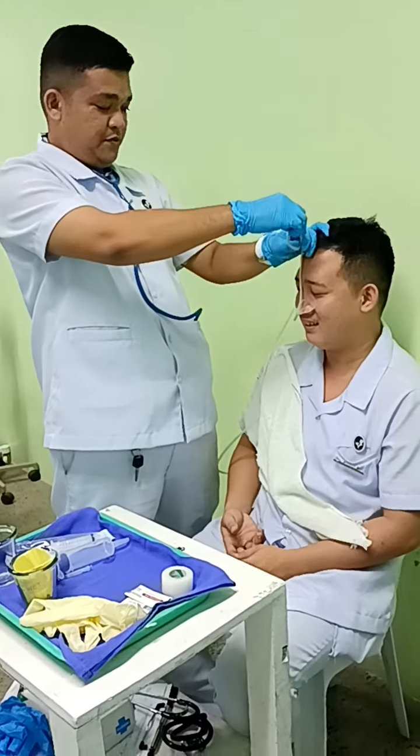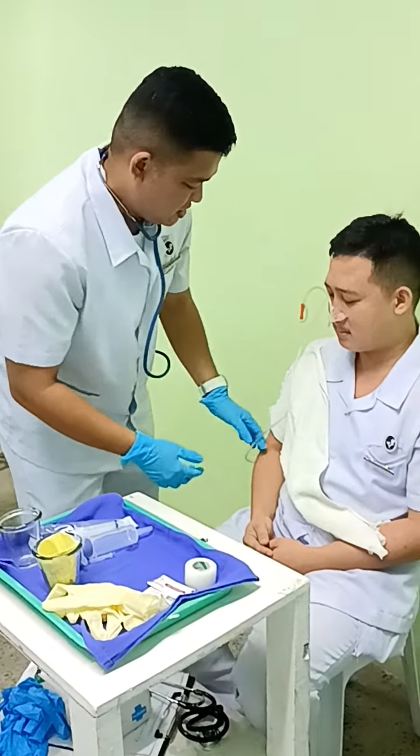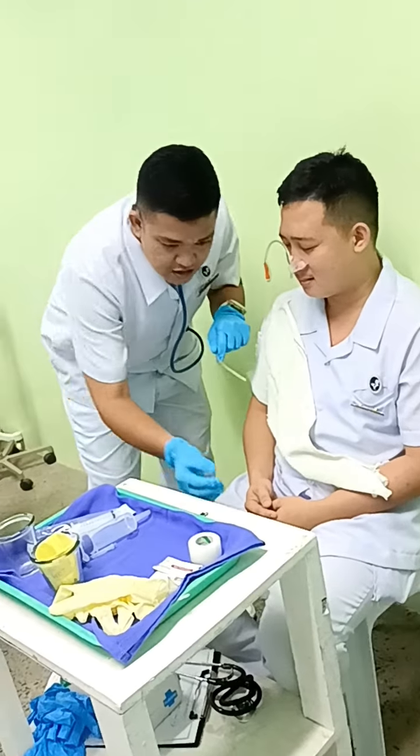After securing, we have also to secure the tube line at the gum of the patient.